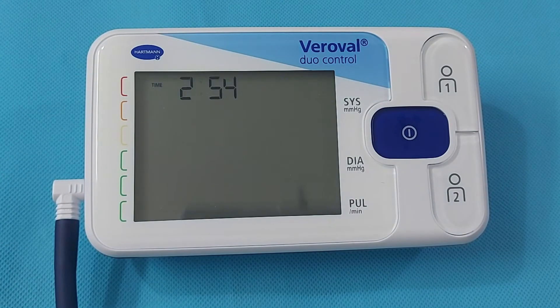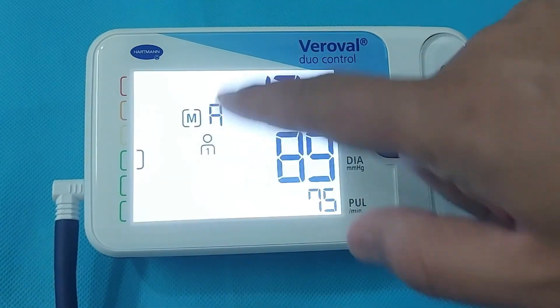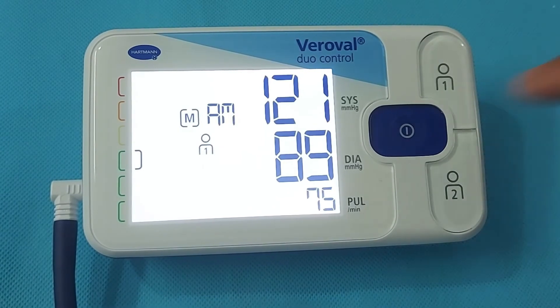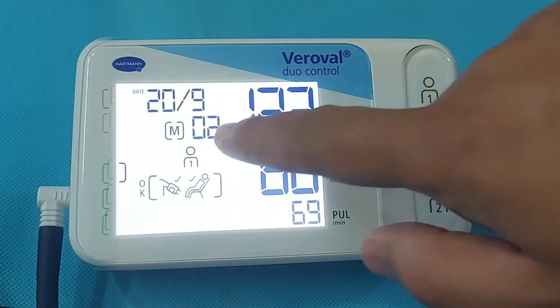If you want to check the previous BP readings, press the User button. Press again and the monitor will show you the average of the last 3 readings. Pressing again will show you the morning readings, and pressing once more will show you the evening readings. Press again and the monitor will show all previous readings with time and date.